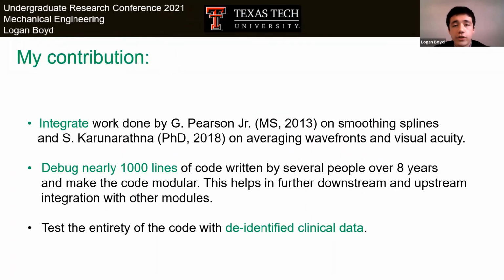My contribution to this research has been to read the literature and the code written by Dr. Iyer and his previous students over the past 8 years, and integrate, comment, and debug nearly 1,000 lines of code. Perhaps most importantly, though, for the first time, we have used actual patient data from keratoconic lens wearers and created a new custom design for an actual patient. This means we are truly one step closer to actually making blind people see.